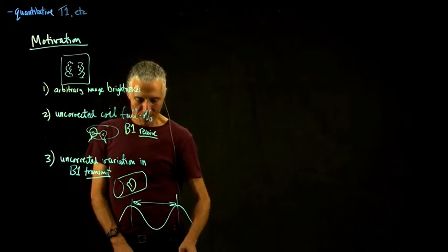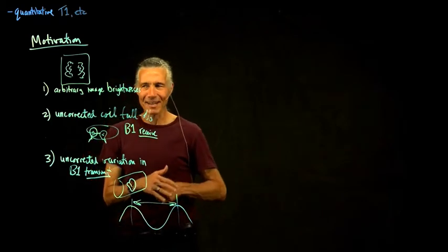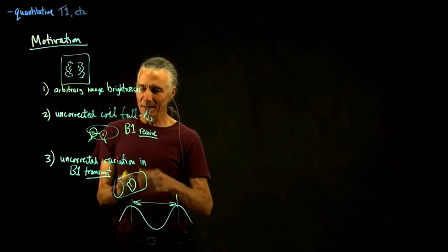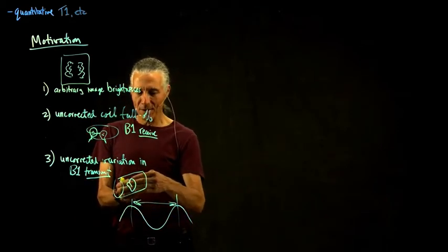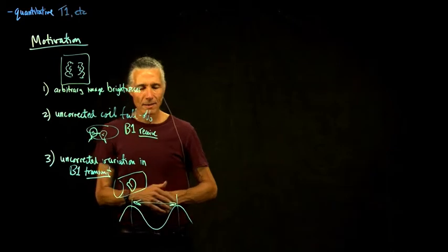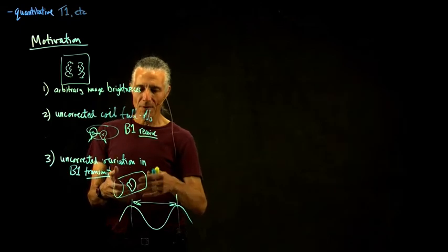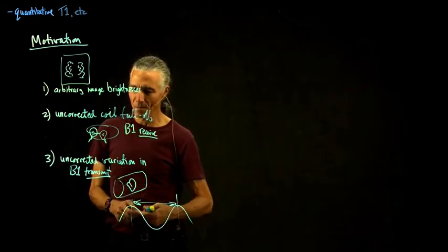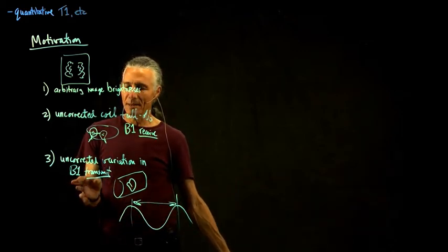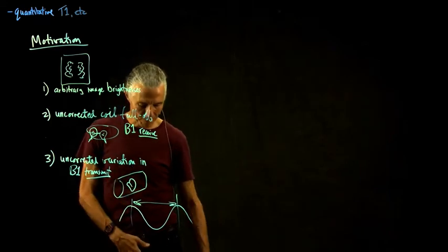And then it can be like your microwave. You heat something up in the microwave and you get a little hot spot. One part's really hot and the other part's not as hot. What that is caused by is these wavelengths going in and interacting with the head like a resonant cavity. So different parts of the head can get different amounts of RF, even though if you didn't put anything in there, the radio waves would be very uniform. So it's not really caused by the coil. It's caused by the interaction between the coil and the actual electrical structure of the head.